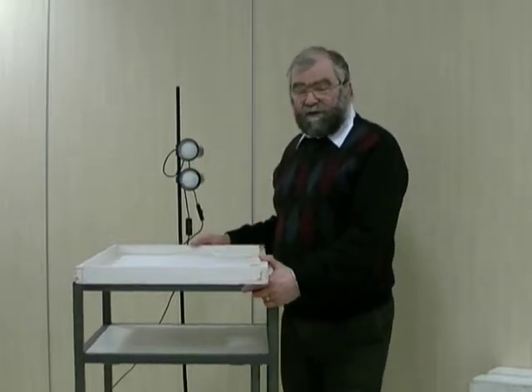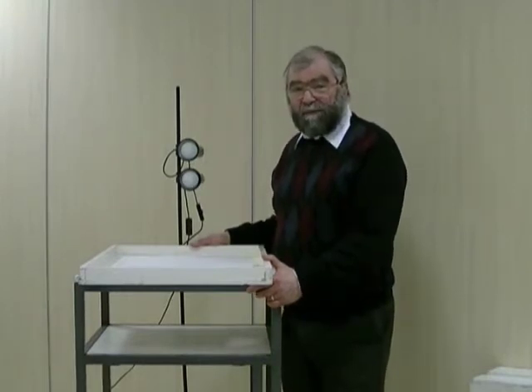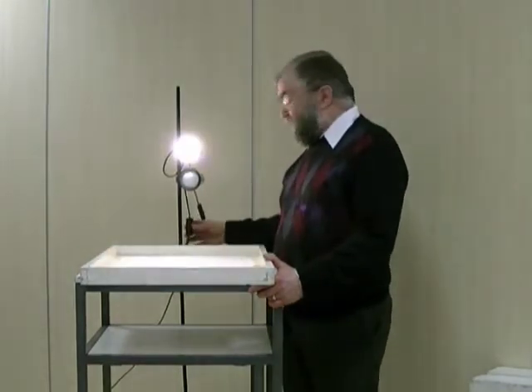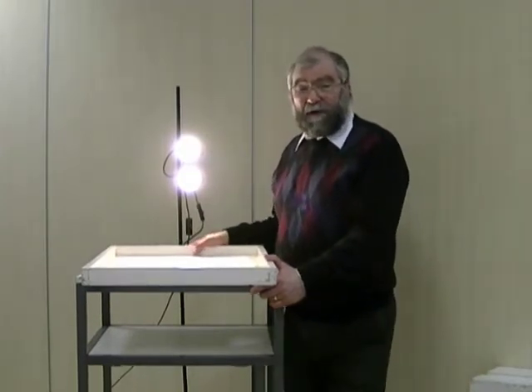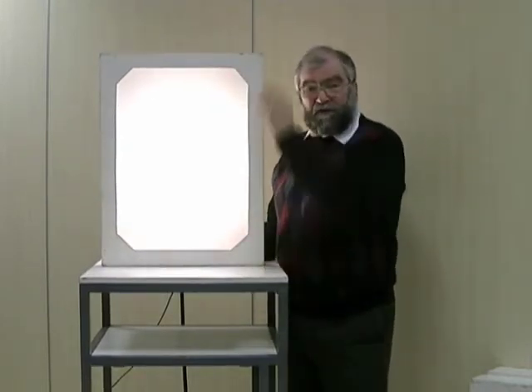This demonstration is going to illustrate the properties of a parallel hole collimator when used with a gamma camera. In place of our source of gamma radiation, we're going to use some light bulbs as a source of visible radiation, and in place of our crystal in the gamma camera, we're going to use this translucent screen. As you'll see with no collimator, we get no image at all.